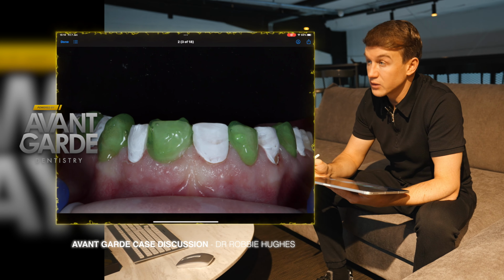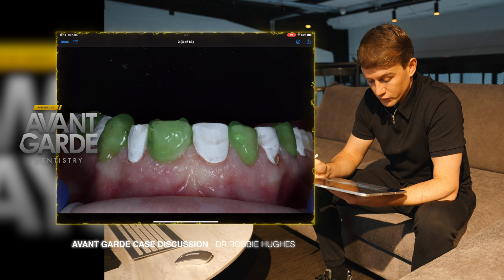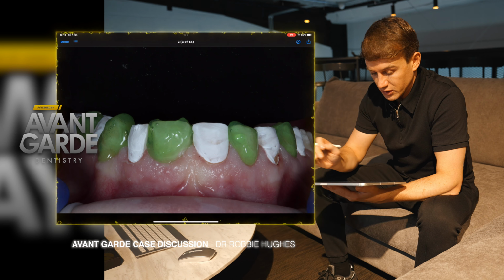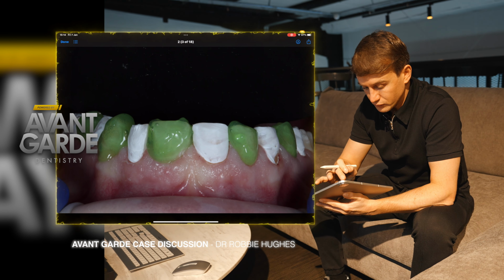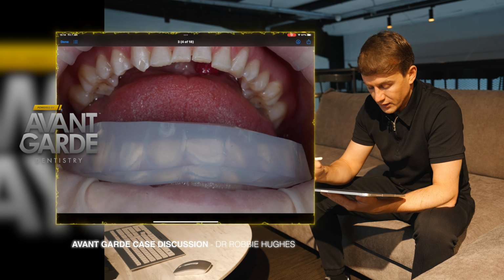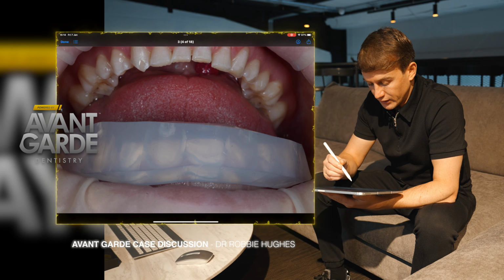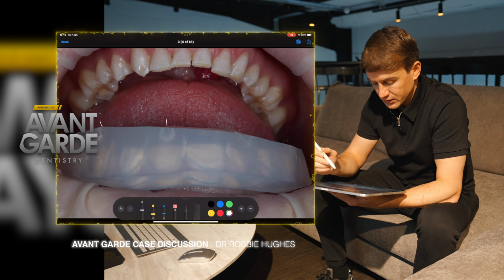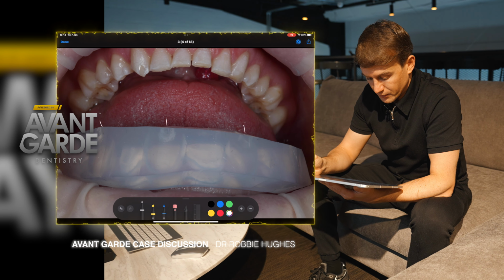Then the teeth which are left behind then undergo the process of etch and bond, with the third stage being application of stent 1, ready to inject heated composite into the channels of the teeth which have been prepared.